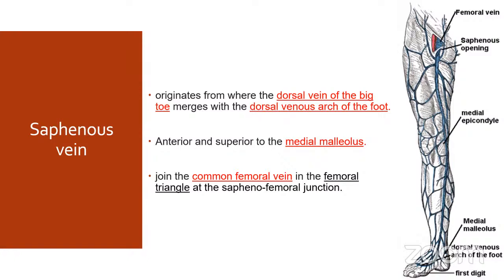So we're just asking our consultant, can we proceed or no? I see one of them, or most of them, just say no, go for the other leg and look for a bigger caliber, because sometimes it's small and it's worthless to extend to the femoral. But we sometimes don't extend if it is small, Abdelilah. But yeah, sometimes they proceed.